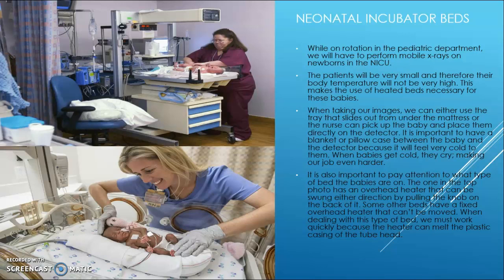We don't want to place them directly on the detector, though. It's important to have a blanket or a pillowcase between them, because it will feel very cold to the baby. And when they get cold, they cry, which isn't good for us.